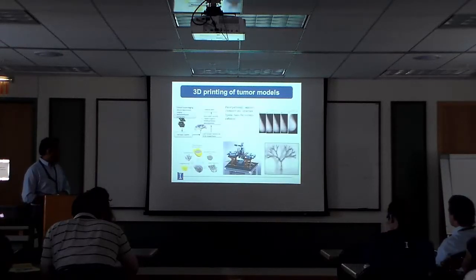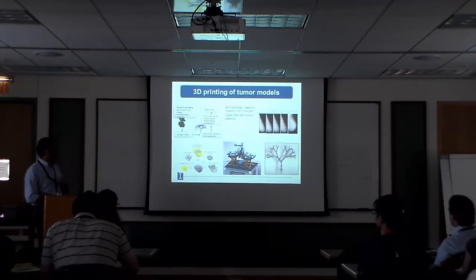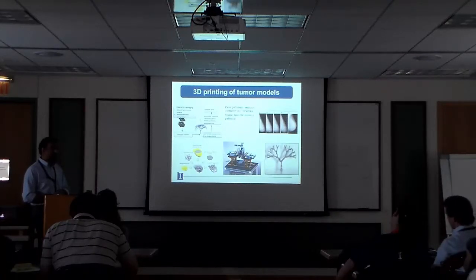This is just recapitulating what we've done with the 3D printer, but essentially the way we're doing this, and this is really the key behind this, is we can use our imaging techniques to figure out some of the rules of organization in the breast, put them into a computer program, and generate a whole human breast at 10 micron resolution fairly rapidly now, in a day or so. In this case, it takes 5 terabytes of storage, but that's a different issue. So we can generate this.